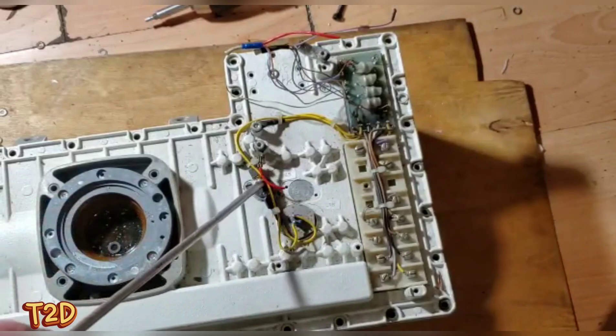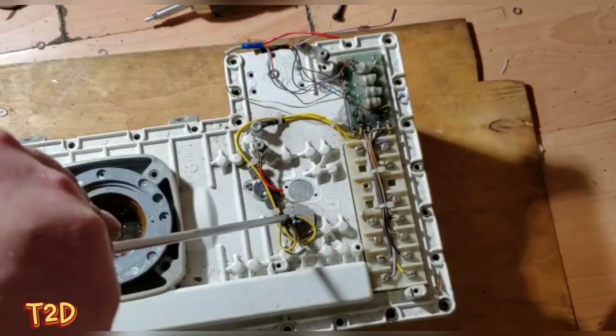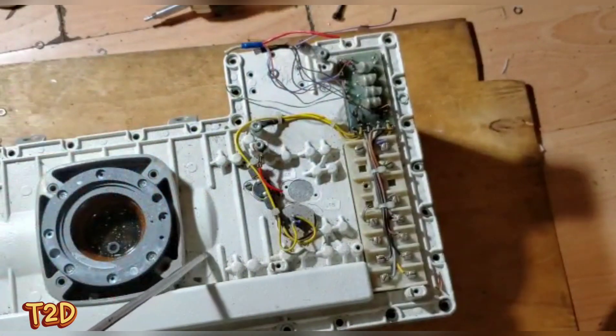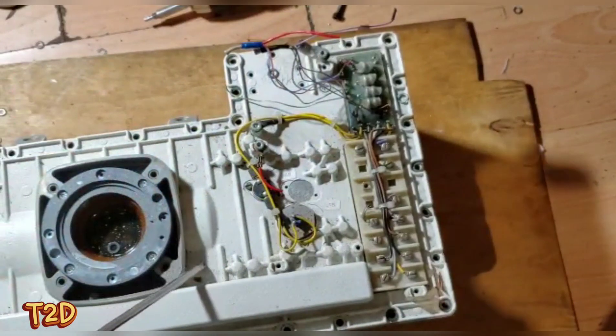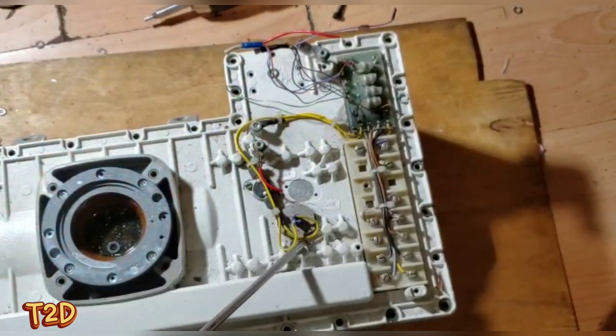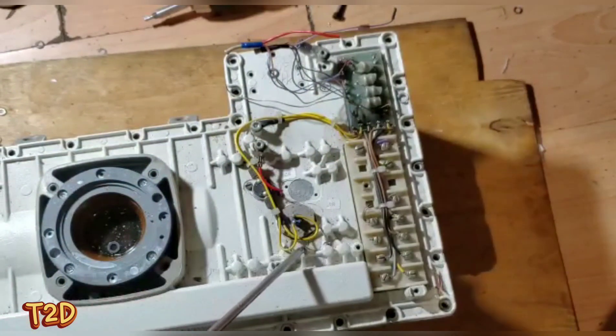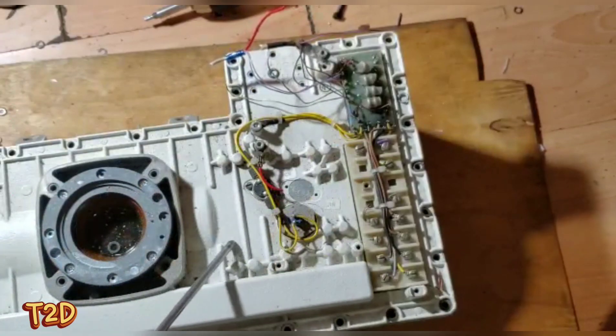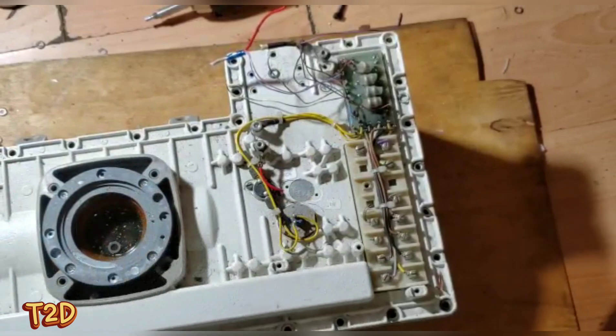There's a bimetallic switch here - if the tank gets too hot it opens and stops the unit running. There's also a pressure switch: if we develop any arcing problems inside, arcing near the high-voltage transformer or across the tube will create pressure in the tank and that pressure switch will deactivate it.